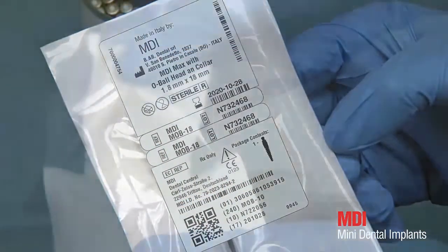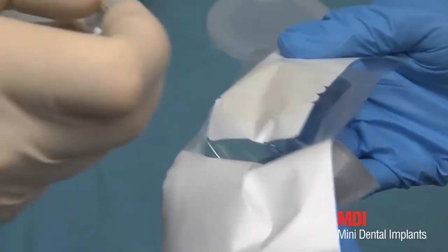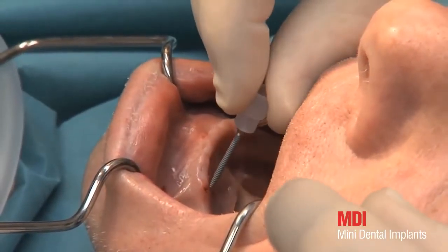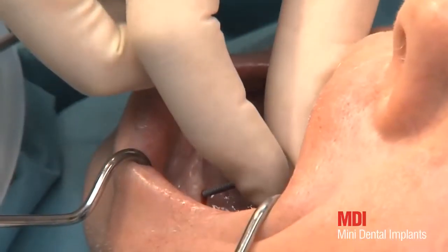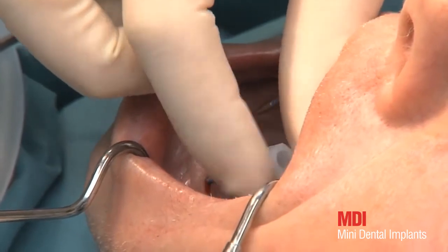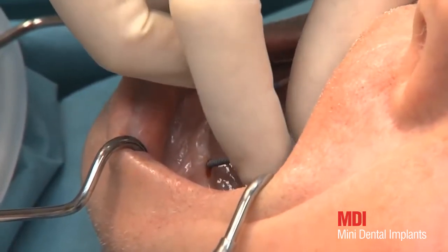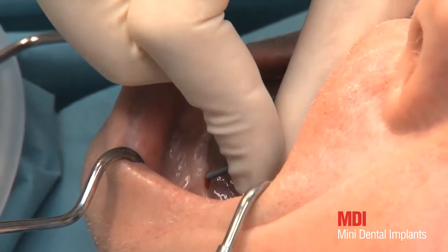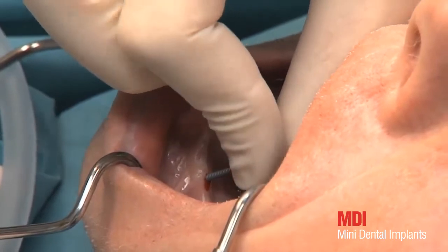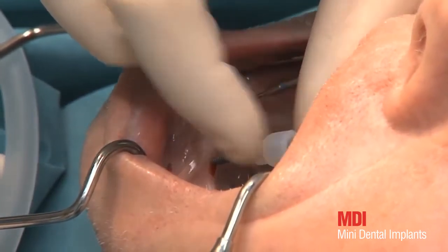The implants are delivered sterile in a small plastic tube. The cap serves to both take it out of the packaging and to position the implant. The first few turns can be executed using the cap until the thread grips the bone, then the cap can be removed. In principle, all implants must be inserted slowly, with a short break after each quarter turn to prevent thermal damage and allow bone compression.